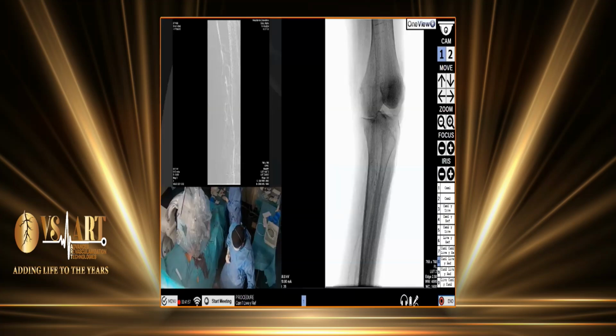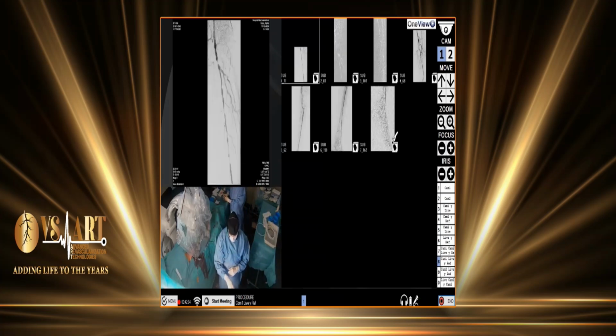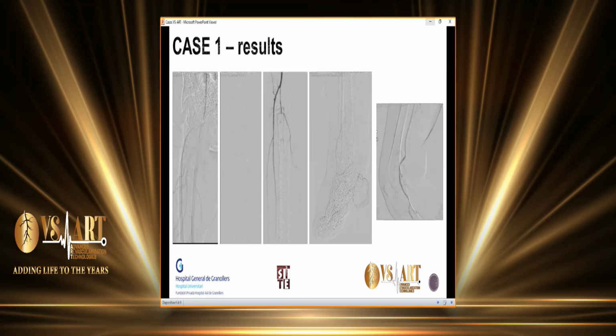Mark, can you share? This is Mahmoud Salah. Hi, how are you? Can you share the initial angio, because we didn't attend the case from the beginning? I don't have the initial angio in the PowerPoint, but maybe we can connect later and prepare the basal angio of yesterday's live case if you prefer. It would be good for you. Yes, it was a total occlusion of the superficial femoral, I believe. Perfect, so we can proceed tomorrow with the next live case.